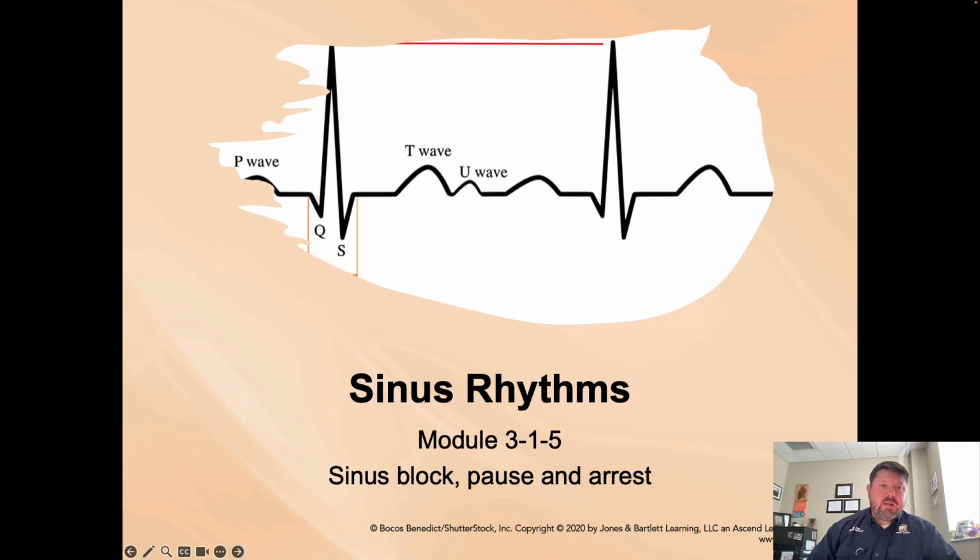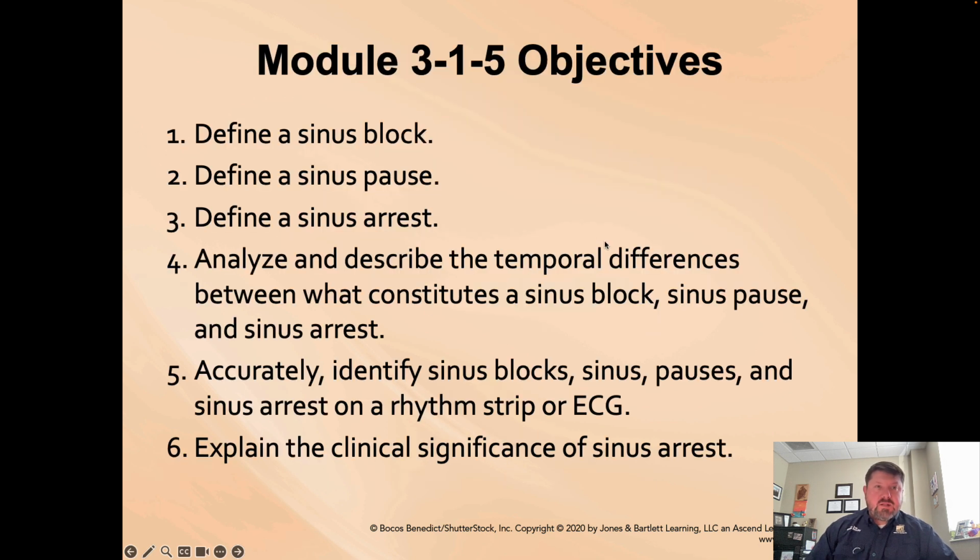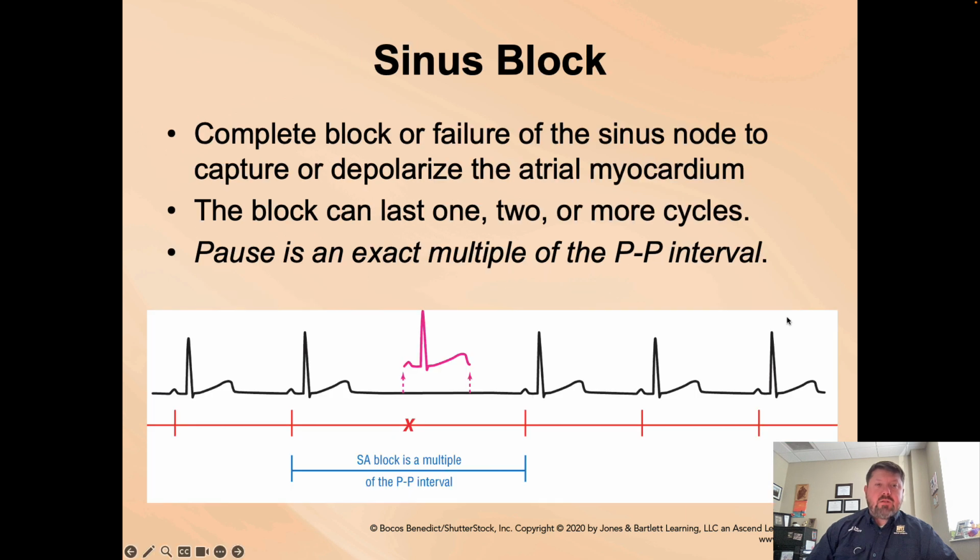So continuing on with sinus rhythms, the last lecture of this module, we're going to talk about sinus block, sinus pause, and sinus arrest. So as part of our objectives, we want to define all three, a block, a pause, and arrest. We're also going to analyze and describe the temporal differences between what constitutes a sinus block, sinus pause, and sinus arrest, and accurately identify sinus blocks, sinus pauses, and sinus arrest on a rhythm strip or ECG, and explain the clinical significance.